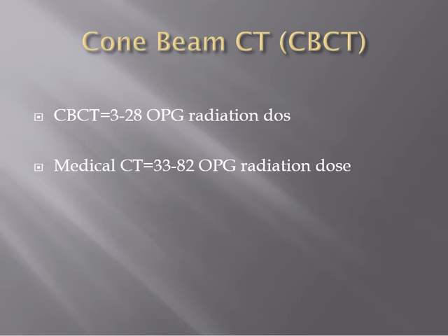A cone beam CT scan has been applied in dentistry since 1998. Cone beam CT scan has many applications in oral and maxillofacial defects, and it is especially used for preoperative planning for the placement of dental implants. Quality and quantity of bone are measured easily from point to point. Selection of the proper length and diameter of the implant can be easily done.